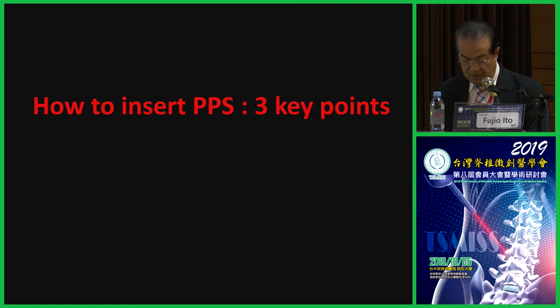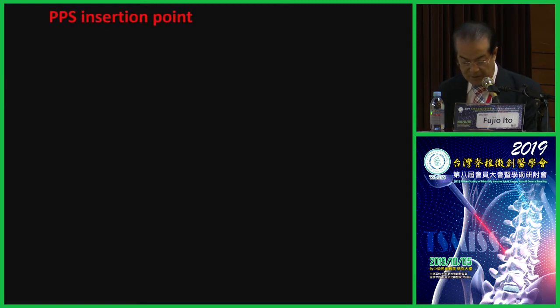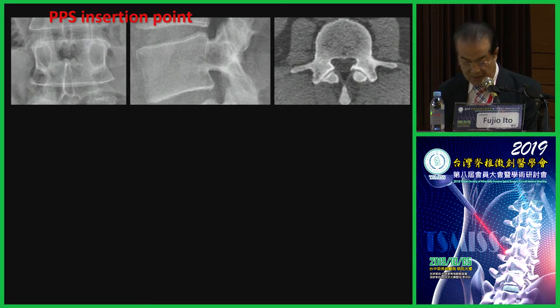There are 3 key points of needle advancement. The PPS entry pathway must be decided, with correct AP and lateral fluoroscopic views. The Jamshidi needle entry point is at the upper quarter of the pedicle under AP fluoroscopic view. The needle is set at the posterior line of the pedicle. As can be seen from the CT image, the tip of the needle is at the outside of the beginning point of the needle.